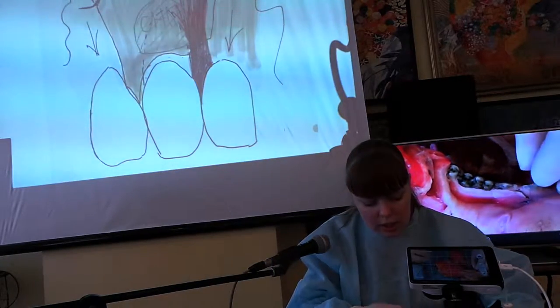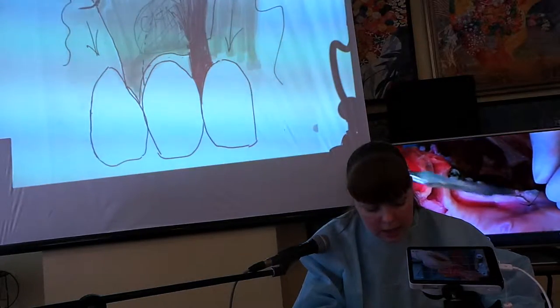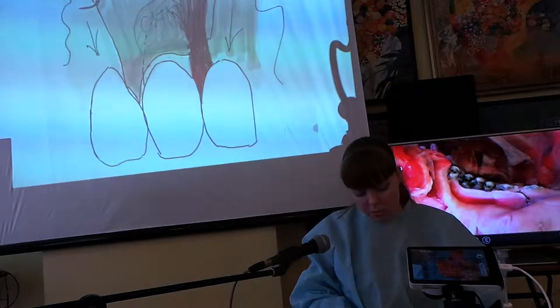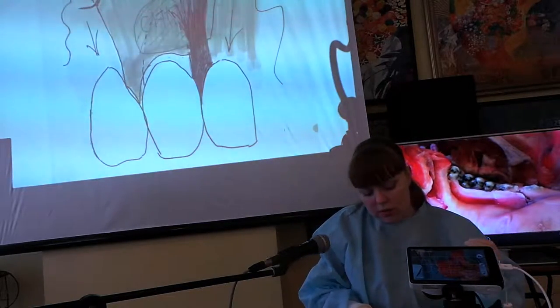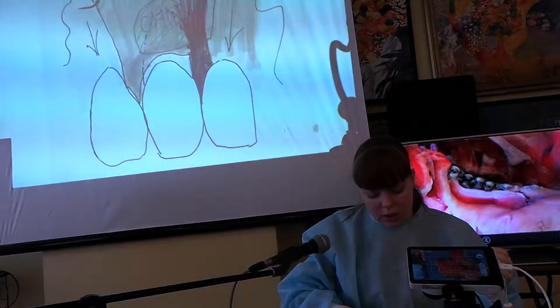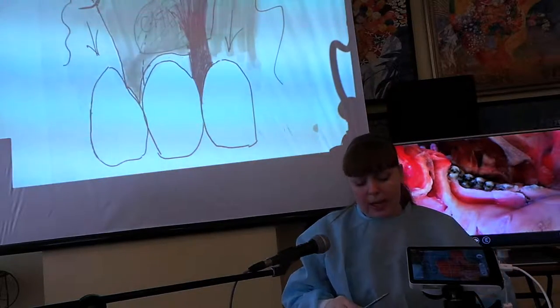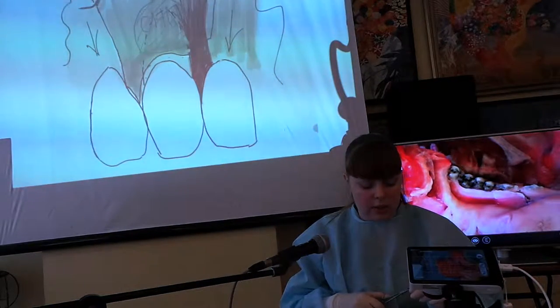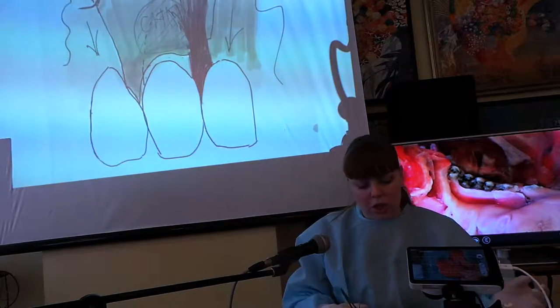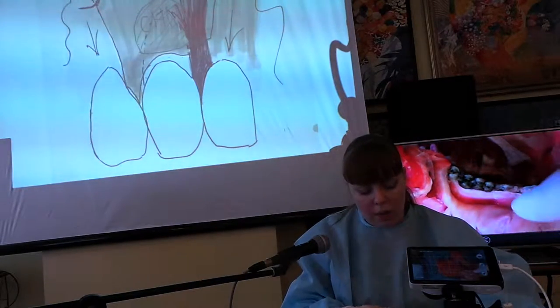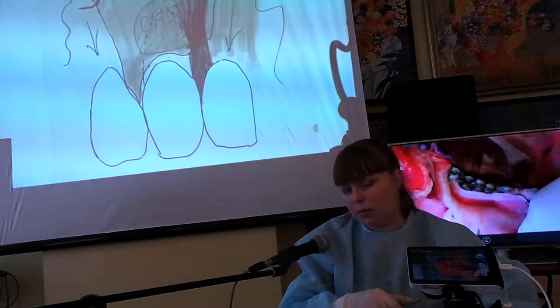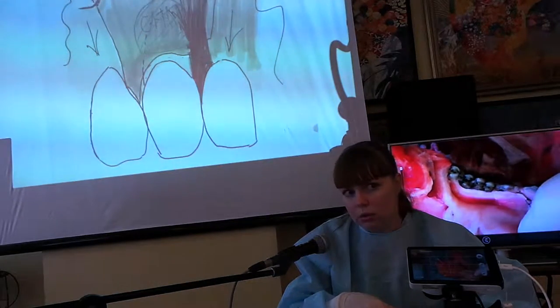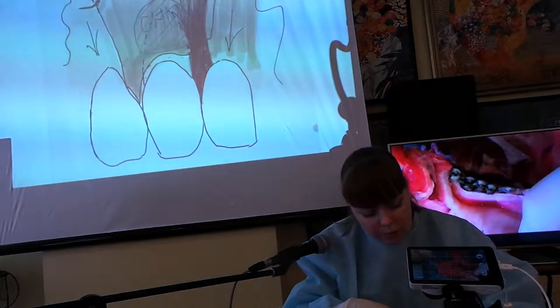Можно сделать их субэпителиальными швами, можно сделать это непрерывным швом, и можно выполнить одиночными узловыми субэпителиальными швами — это никакого принципиального значения не имеет. Принципиальное значение имеет двойной петлевидный обвивной шов, который мы выполнили, сопоставив хирургически с анатомическим сосочком.